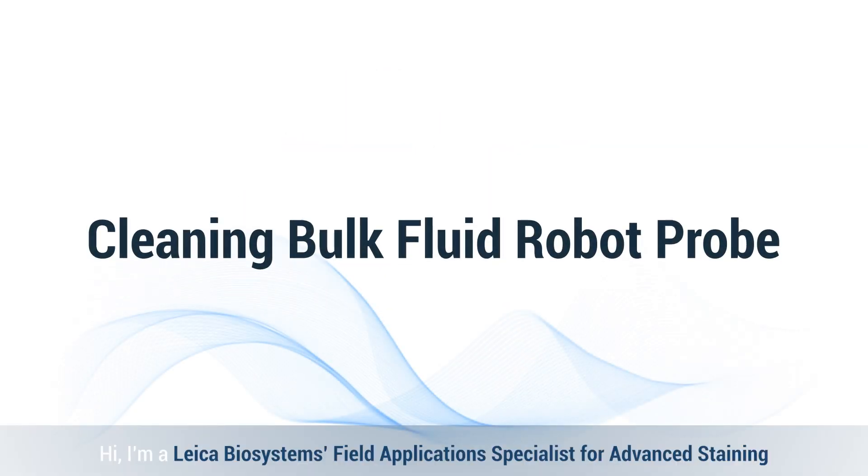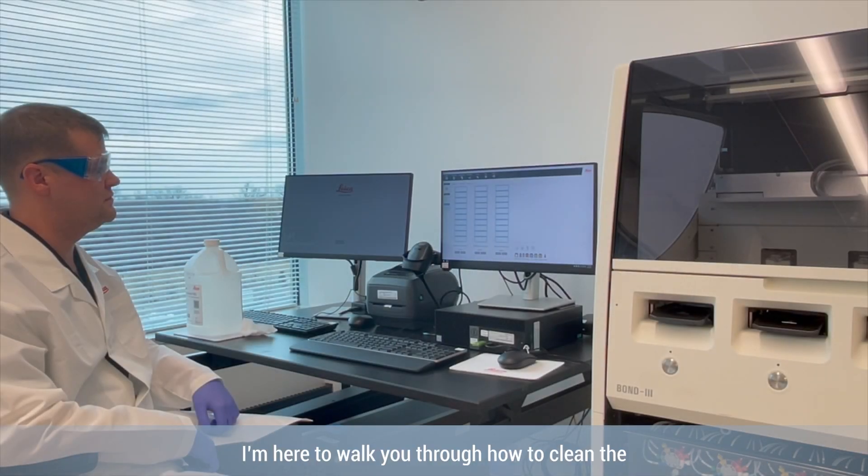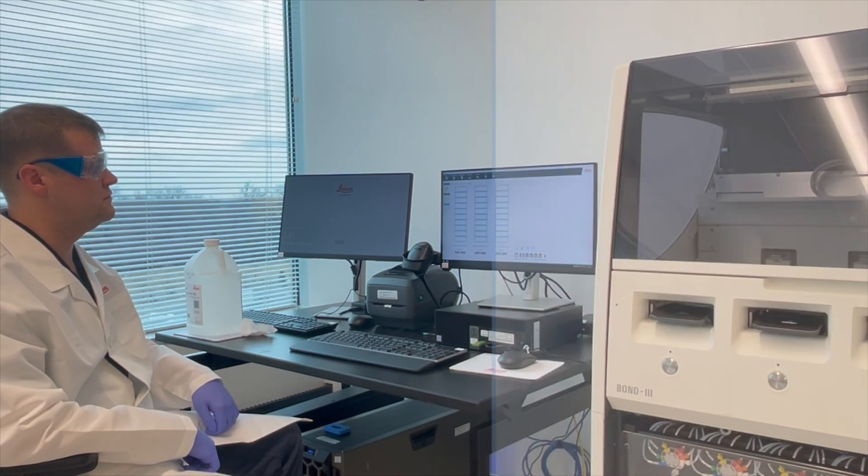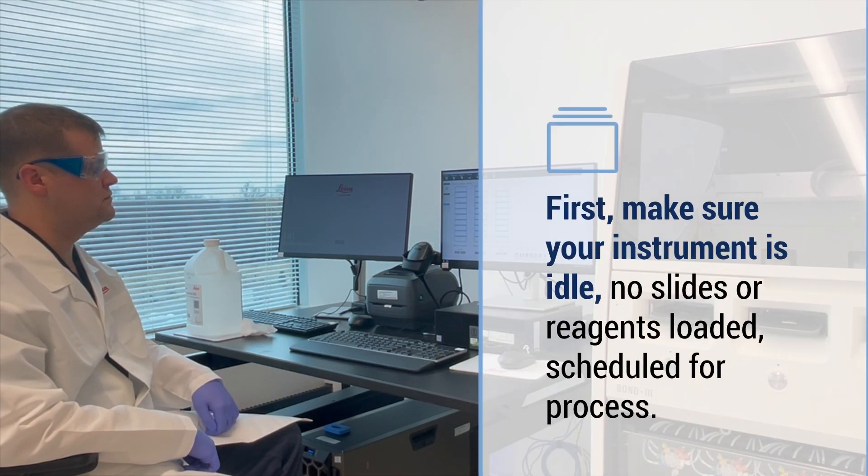Hi, I'm a Leica Biosystems Field Application Specialist for Advanced Staining, and here to walk you through how to clean the bulk fluid robot probe, also known as the BFR. This is part of the monthly maintenance process that might seem complicated but it's actually pretty simple. First, make sure your instrument is idle.